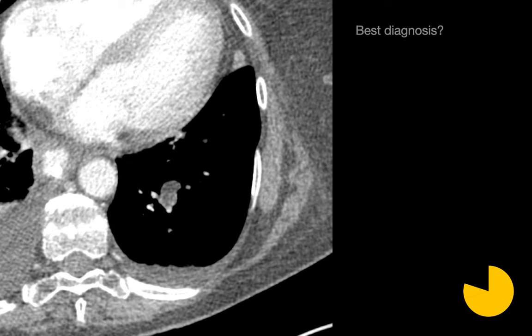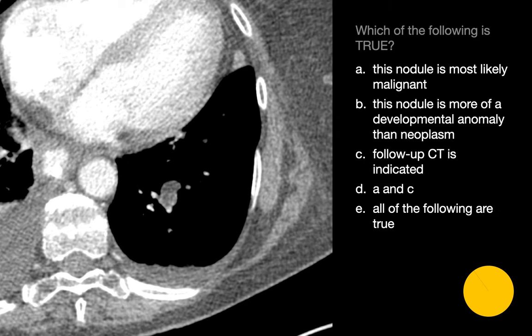What's your best diagnosis for this lung nodule? The well-circumscribed lung nodule in this patient's left lower lobe is of the same attenuation as the subcutaneous fat in the patient's chest wall. The presence of macroscopic fat in a circumscribed lung nodule informs us that this nodule is a pulmonary hamartoma. Although pulmonary hamartomas are usually classified as benign neoplasms, they are probably more of a developmental anomaly than a true neoplasm. Pulmonary hamartomas are benign, and no follow-up CT surveillance is indicated.